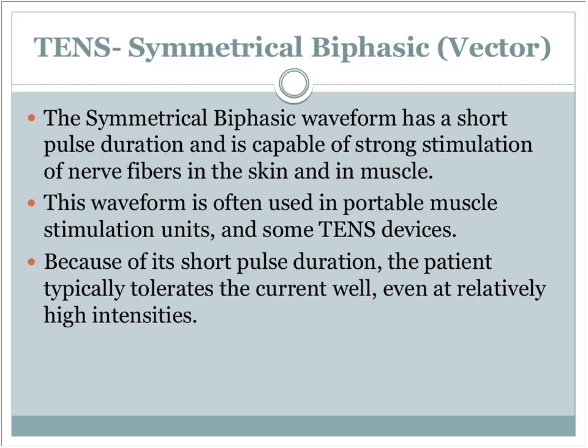So it's really nice to be able to do that for people before they have some irritation, so they can be more effective doing their treatment. And yes, sometimes I've done it at the end of treatment because what we've done has created more discomfort, and I want to give their bodies time to reset that pain level. So I will do this for them, not expecting a permanent effect, but to make it more comfortable for them, because if they just wait a half an hour, the pain level will naturally decrease on its own anyway. So let's give them a little comfort while they're waiting for that to occur.